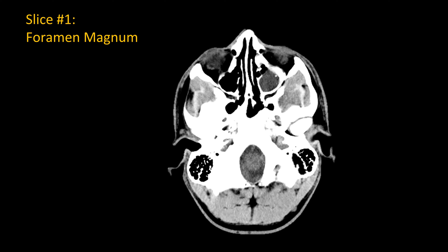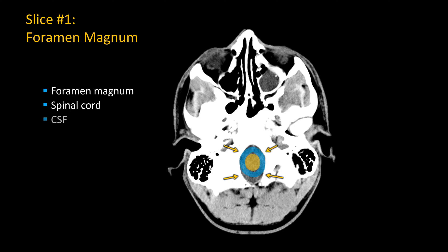Starting with the lowest level at the foramen magnum, you should be able to see centrally a soft tissue density spinal cord, which is surrounded by relatively hypodense CSF. If you see the foramen magnum filled with soft tissue density in an acute setting, you are probably seeing acute tonsillar herniation.